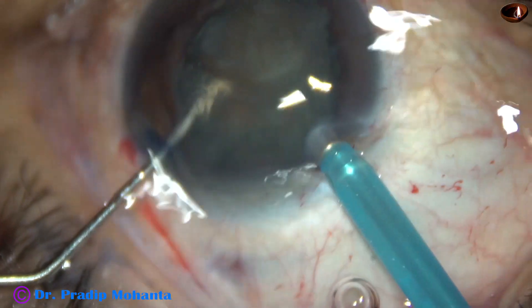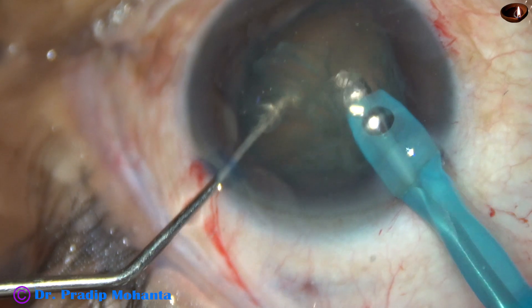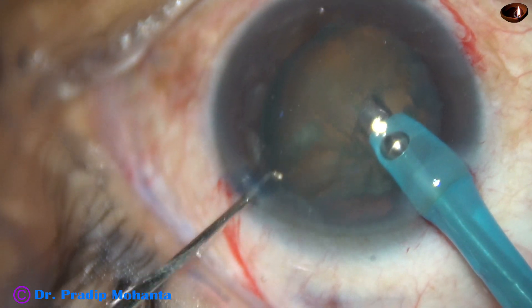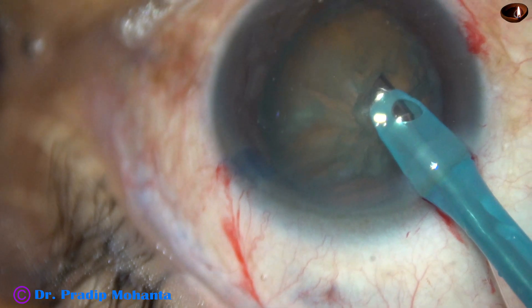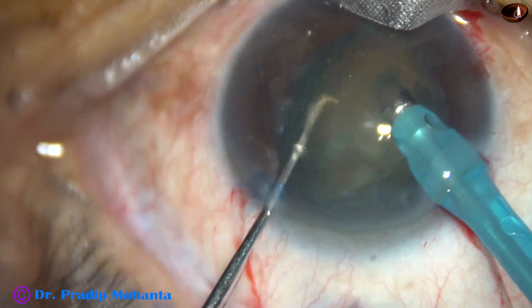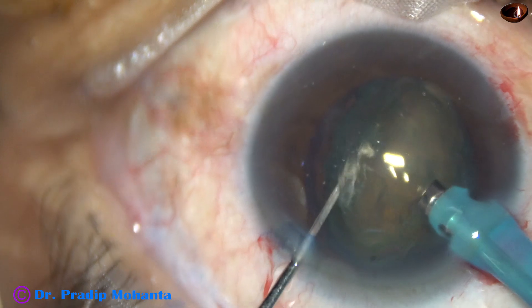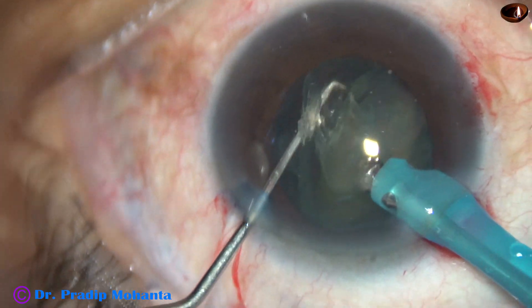So the tip of the phaco needle goes in, and you just start eating off. First, the portion which is supracapsular — the portion which has come out of the capsular bag — just start eating off that portion. Face the lens mass, support the nucleus from the other side, and start eating it off: one bite, two bites, three bites, four bites — lift it off a little bit — fifth, sixth, seventh, eighth bite. And then you just keep eating off.